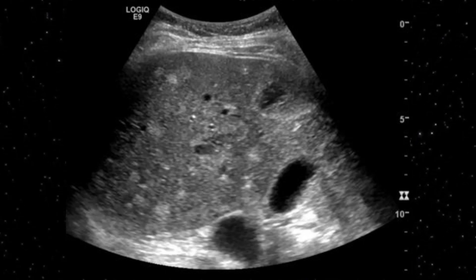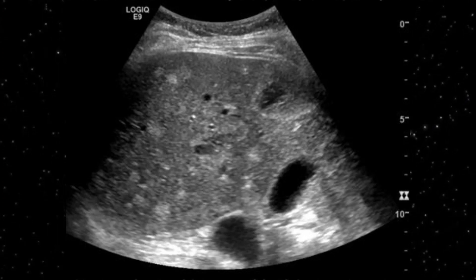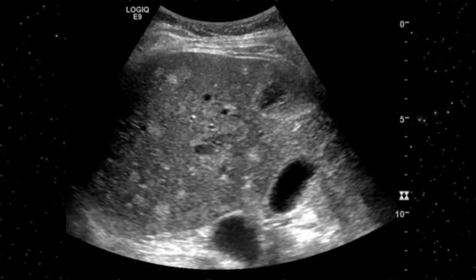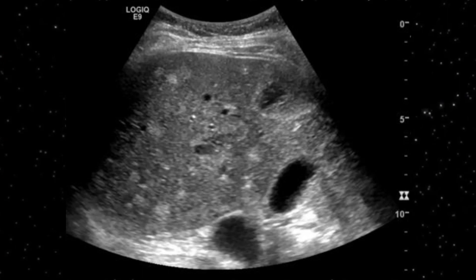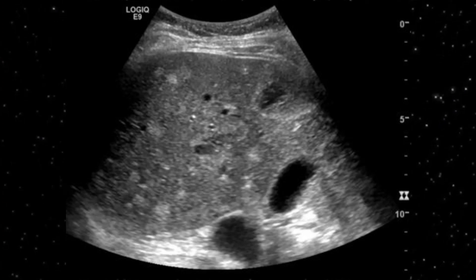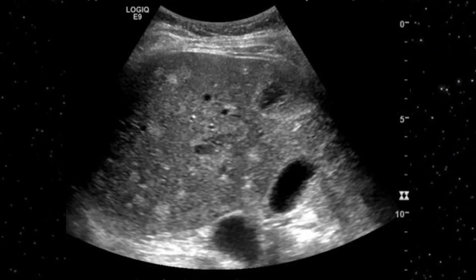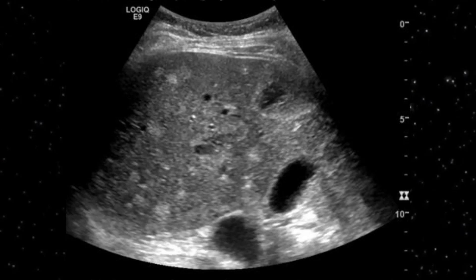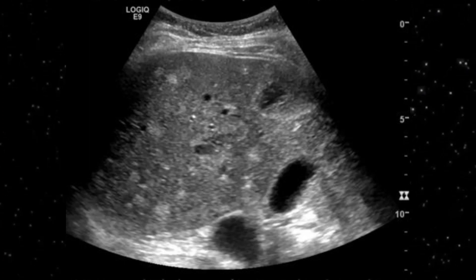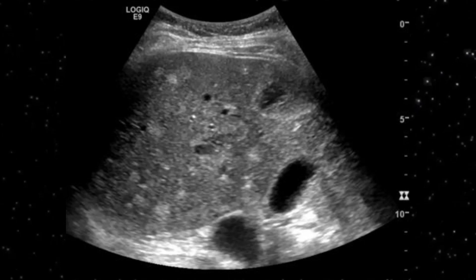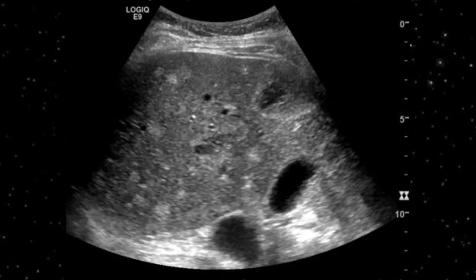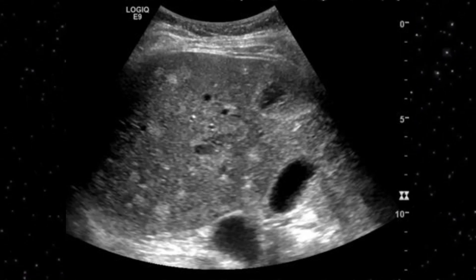Biliary hamartoma may appear as a solid nodule or as a cystic lesion. On this slide you can appreciate multiple small, well-defined, one to three millimeter echogenic nodules. At first instance you might think these are metastatic deposits; secondly, they may look like multiple hemangiomas; and thirdly, some abscesses can present similarly. But this is biliary hamartoma — neither metastatic deposits, hemangioma, nor abscesses.